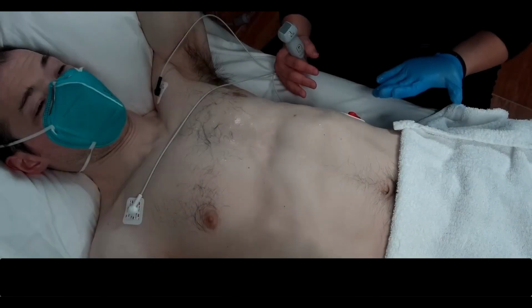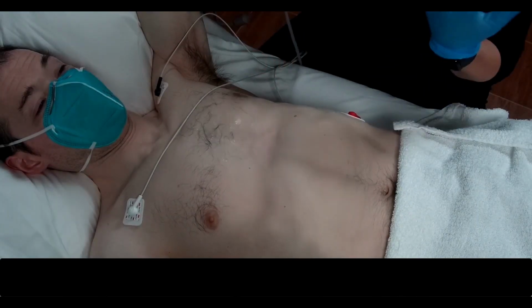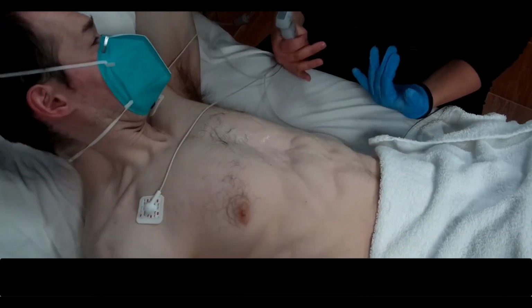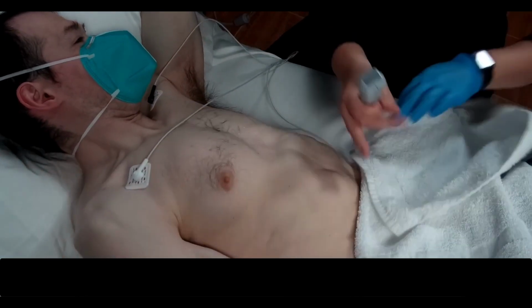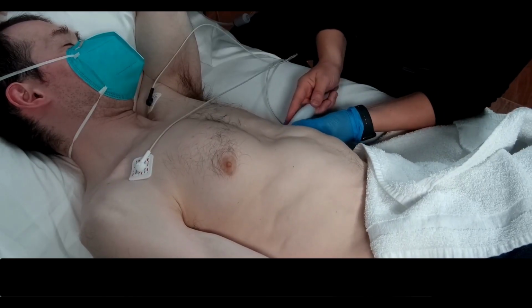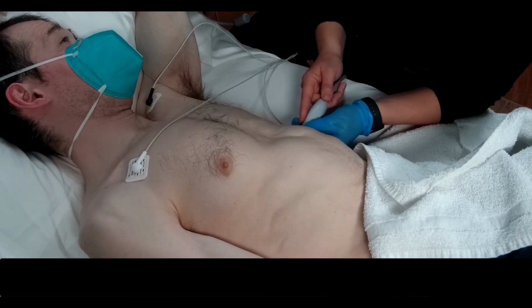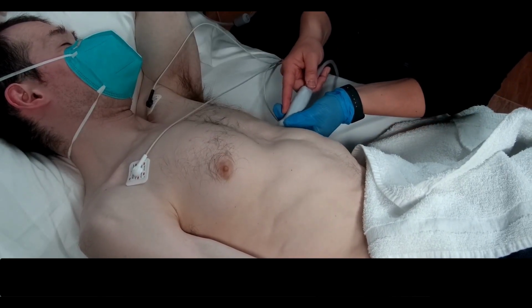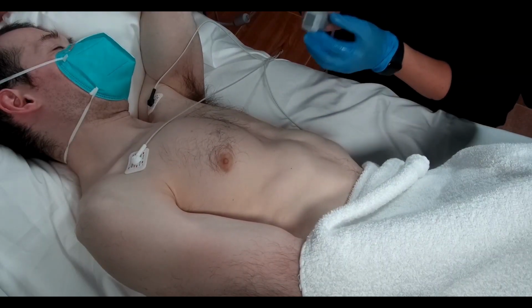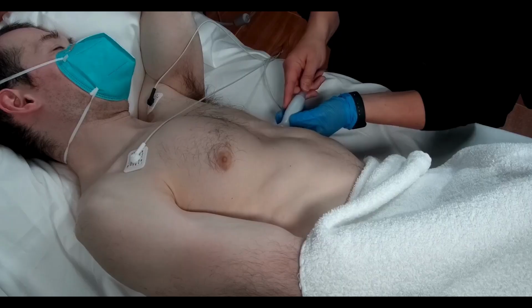The second measurement of the calculation package is taken in the apical 5-chamber view. For optimal imaging, it is advisable to roll the patient onto their left side and bring their left arm towards their head. This brings the heart forward in the chest and makes it easier to see between the ribs and around the lungs.